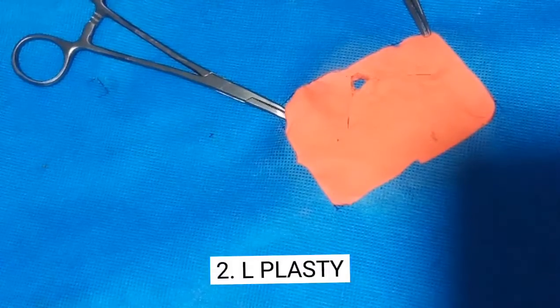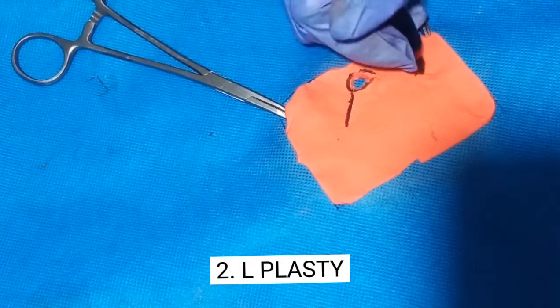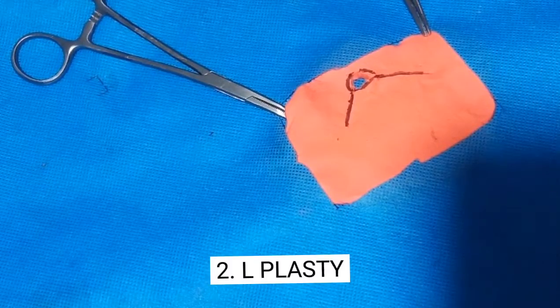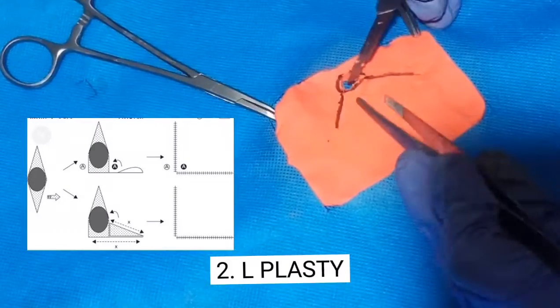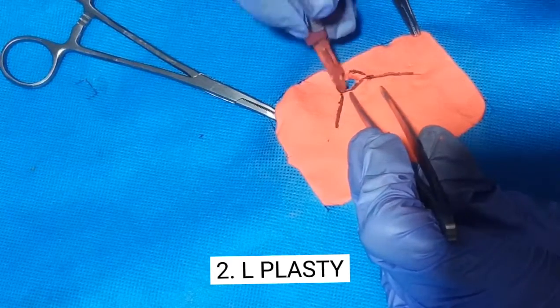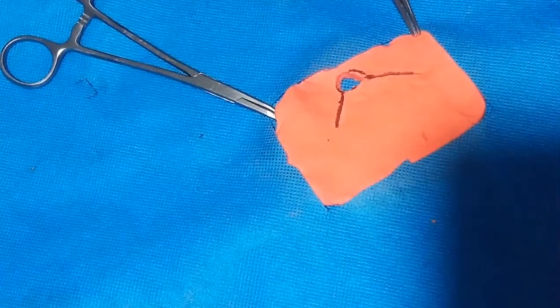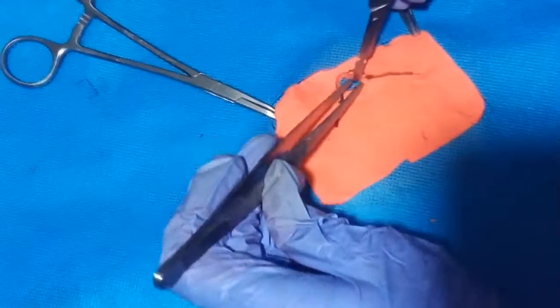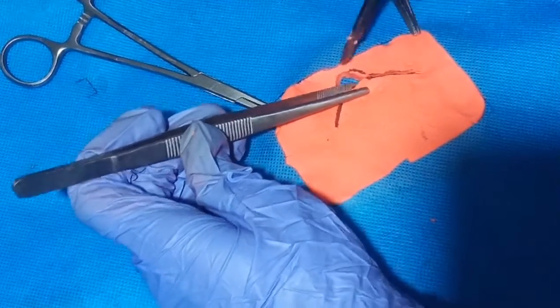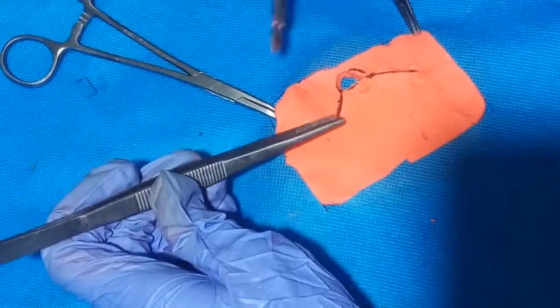Next, we have the L-plasty, also known as the O-to-L advancement flap. It is a single tangent flap where the incision is made at one end of the defect. Here I am removing the epithelialized portion of the granulation bed, creating an O shape. Note that it is better to create two adjacent short flaps rather than one long flap, which has greater risk of necrosis from inadequate blood supply.